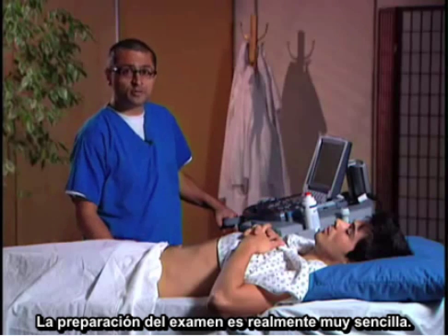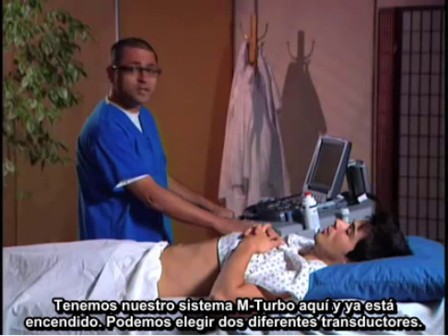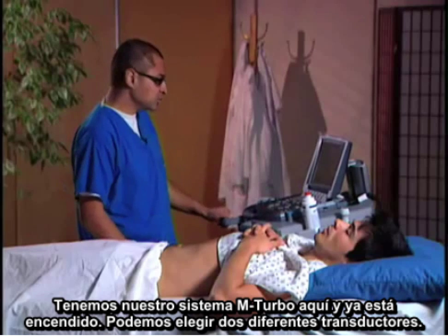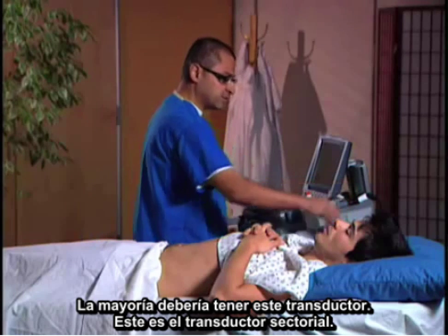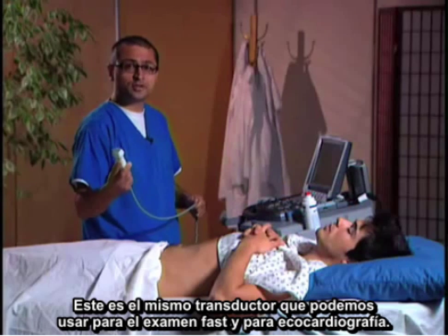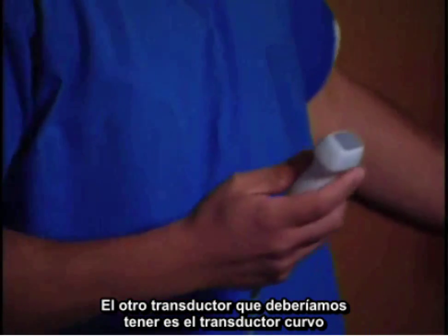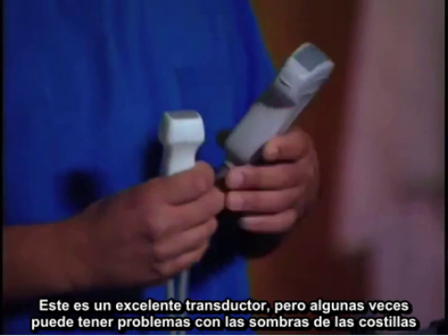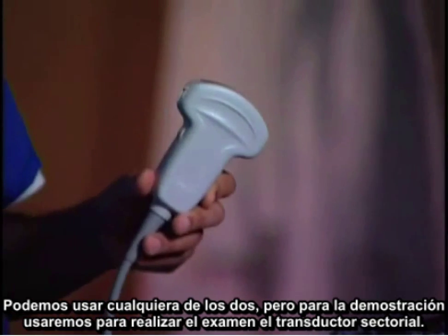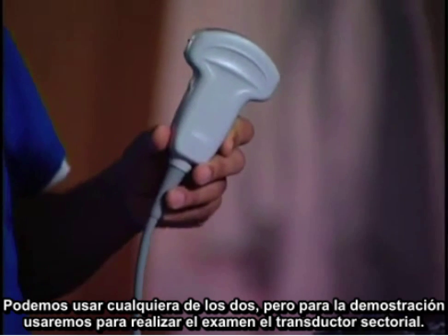The exam setup is very straightforward. We have our M-Turbo system here, already powered up and on. We have a selection of two different transducers. Most of you may already have this phased array transducer — the same one you use for the FAST exam and echocardiography. The other transducer you may have is a curvilinear transducer, which is excellent though you'll sometimes have problems with rib shadows. You can use either one, but for today's demonstration I'm going to use the phased array.